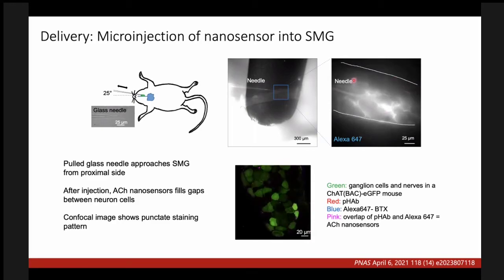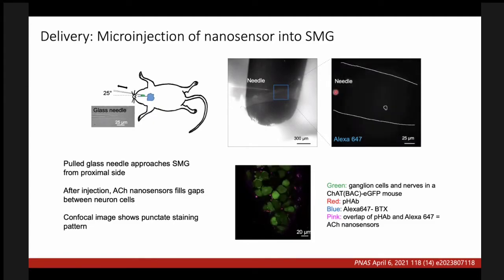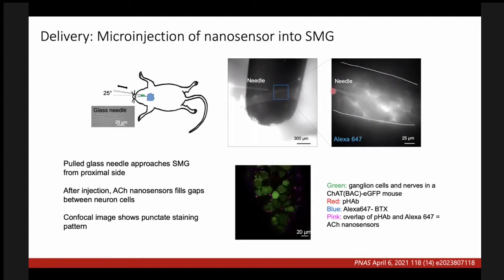And you can see that image here. So this is the tissue delineated here. You can't see it here, but there would be a spatula behind here to pull it taut. And that needle, and she's pumping in little bits and little bits of the sensor in solution. And so she's pumping in more and more, you can see here. And every time she pumps in a little bit of sensor, more of it labels the tissue, until finally, oh, she got a really good injection there.